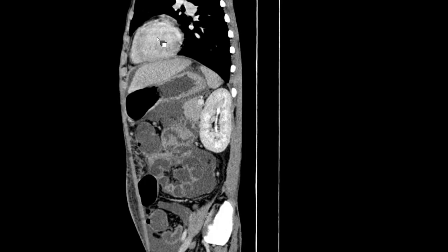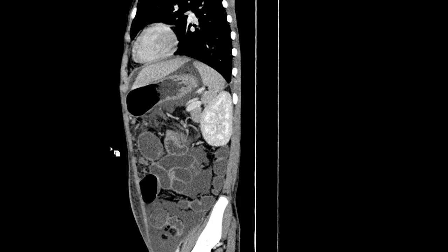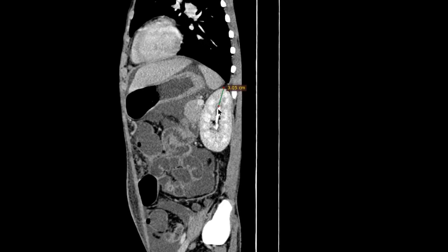And left kidney, why? Because heart is seen, only a small part of liver is seen, and we can see that, yeah, this is the stomach which is here. So this is a small part of liver, left lobe of liver, this is spleen, this is heart, this is stomach, and therefore this is left kidney. Without even correlation, you can judge from the sagittal scan only. So this is the maximum size of the left kidney, you can tell.